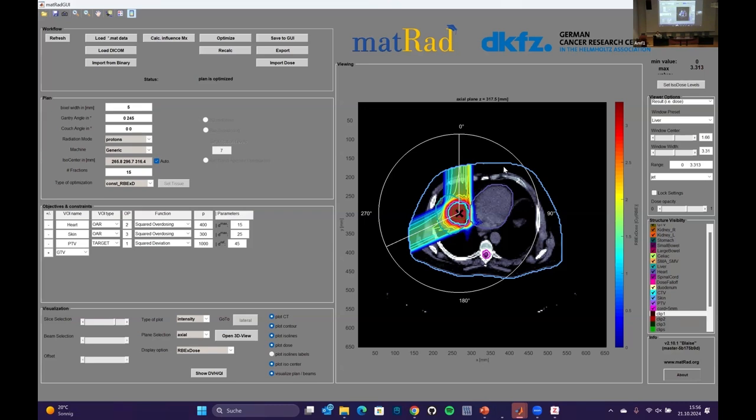Photons have an exponential curve, so if something fills, of course, this exponential curve will also slightly shift. It will basically be a little bit steeper or shifted a little bit, but this is tiny. The dose falls off a little bit earlier, and I will get a slight underdosage somewhere and a slight overdosage somewhere. And it will be compensated by beams coming from other angles. But for protons, this one beam will be shifted completely, and I have only 2 beams or maybe 3. So there is a real, substantial problem with uncertainties.